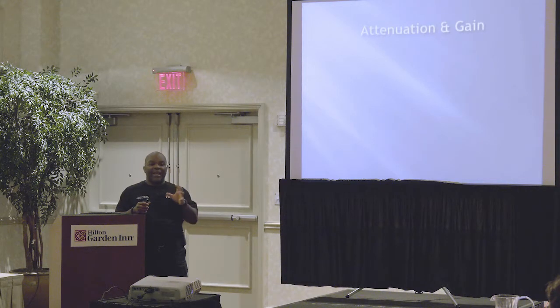So you can control the gain. And you say, well, what exactly is controlling the gain? It's basically allowing the ultrasound to listen longer. Does that make sense? No, it doesn't.